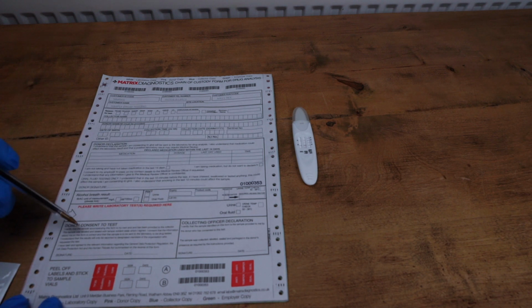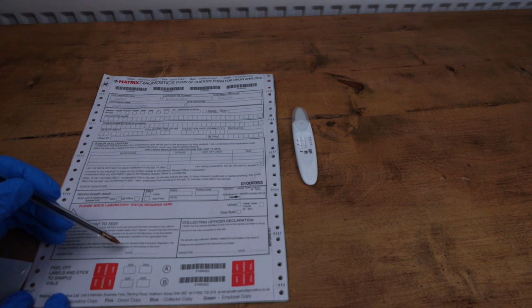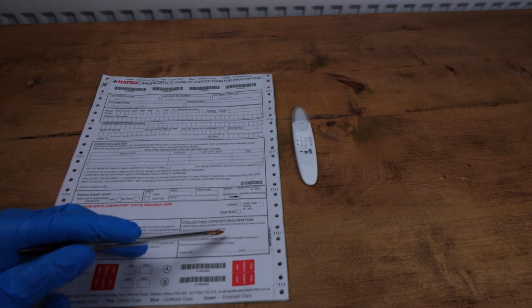And underneath that, the donor consent to test. So I invite the donor or employee to read that statement there. Once they've read it, I ask them then to sign it and date it. You are classed as the collecting officer, and you will need to sign and date that declaration there.